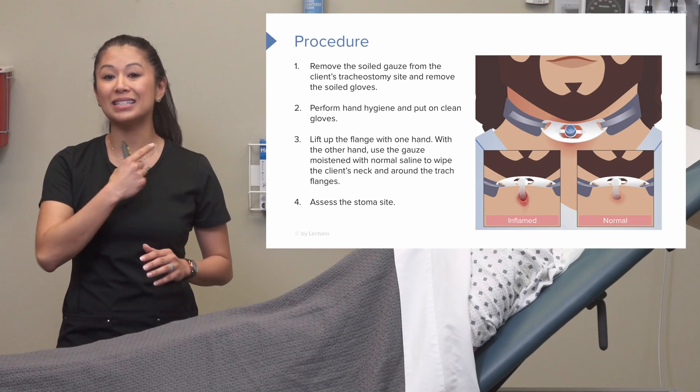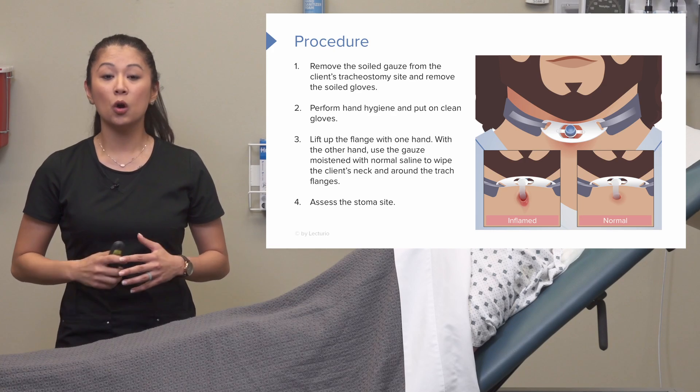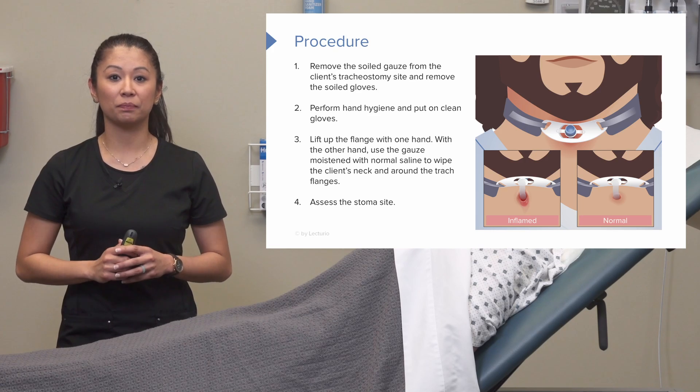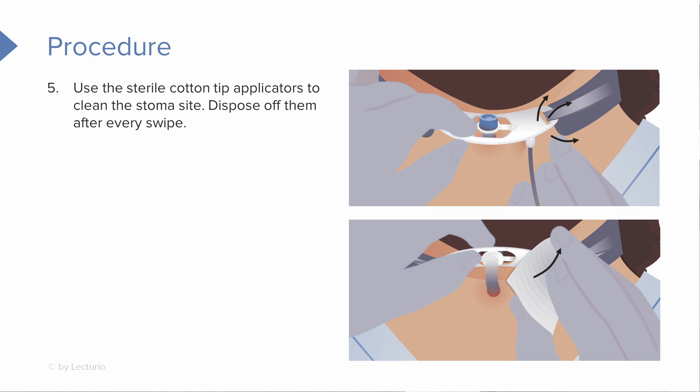Now is a good time, since we removed that old gauze, to assess that stoma site and see if there are any signs of infection or if the stoma site looks healthy. A good tip is to use sterile cotton-tip applicators — this is really helpful because you can get underneath that trach and use those sterile gauze pads as indicated to clean that stoma site and all around the tracheostomy flanges, getting rid of them after every swipe.